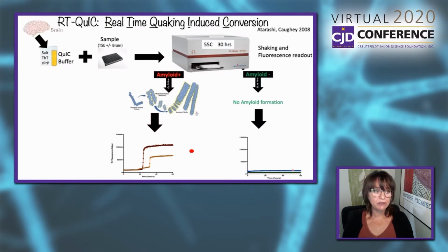So our group has been looking at the use of buffy coat. These are particular cells within the blood component that you can see right here. It's a group of different cells that we know carry prion infectivity. We put those cells into this assay, making modifications to this RT-QuIC assay, in a similar system. Our goal is to determine whether we can detect this amyloid versus no amyloid.